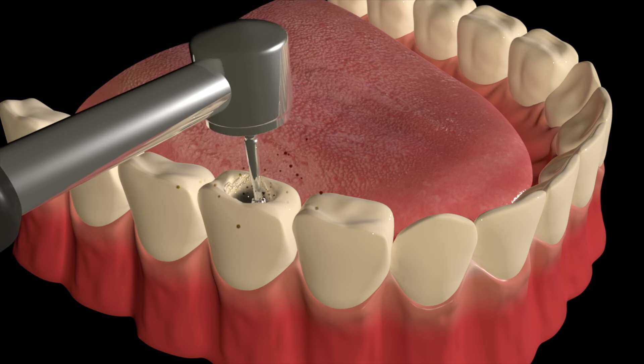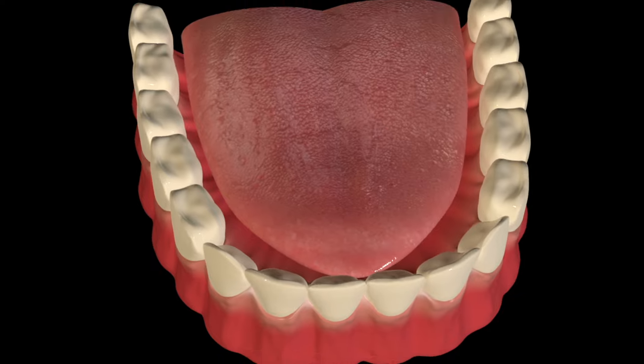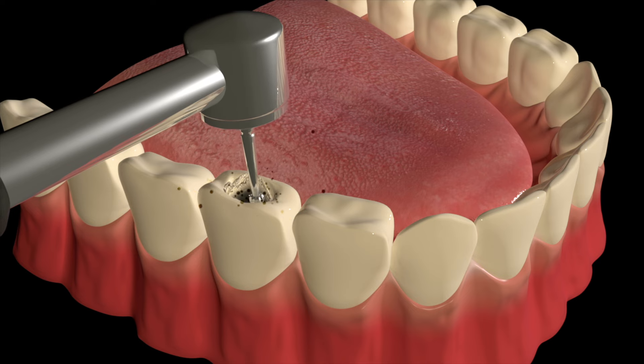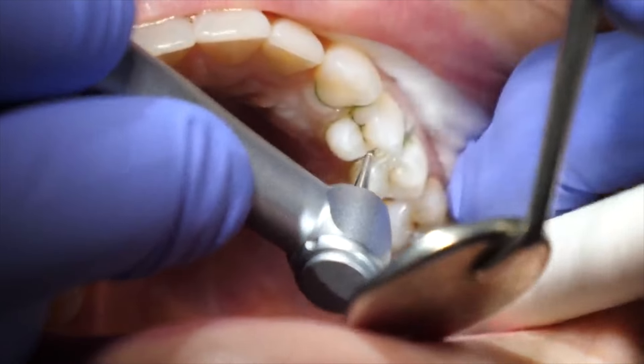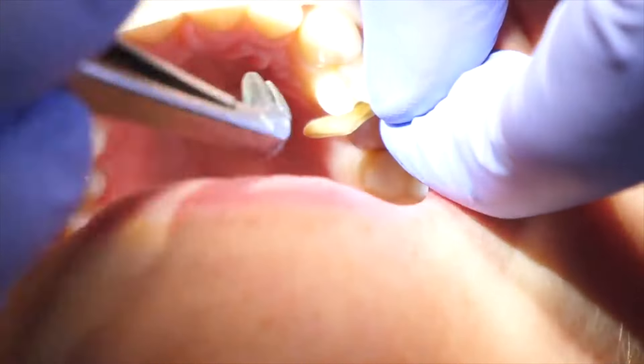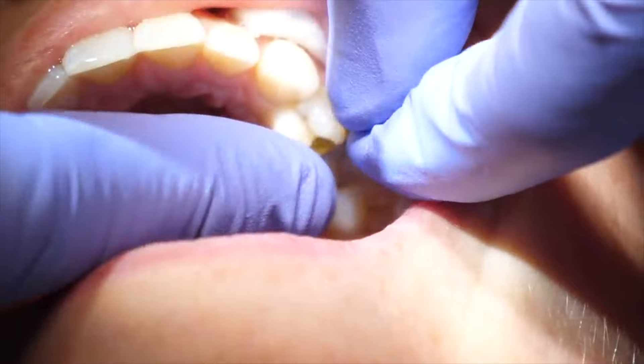But until you start drilling, sometimes you can't see it on the top of the tooth until you open it up, like we were talking about earlier. Now they are done prepping the tooth and have effectively removed all of the tooth decay.